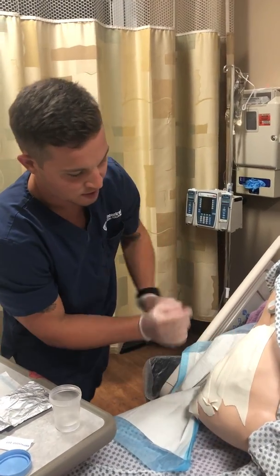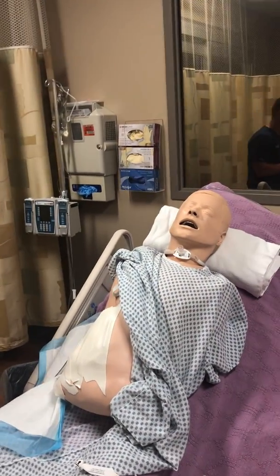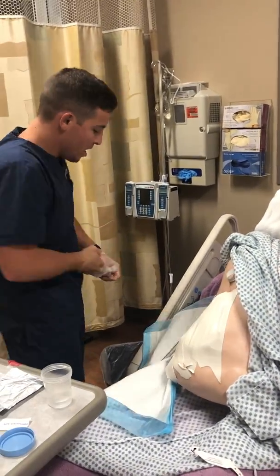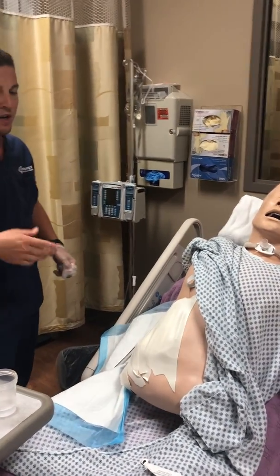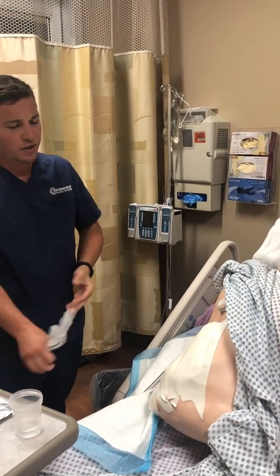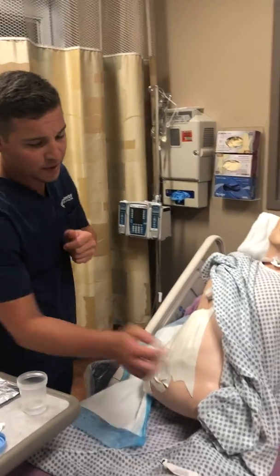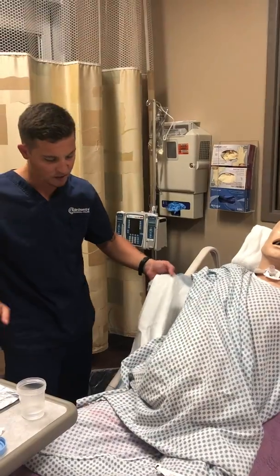Very good. So let's check in. How are you feeling here, Jennifer? We got everything changed here. I can get you covered back up. What I want to do is I'll want to initial the date, time, and my initials on here, just for our dressing change purposes. We're going to cover you up here, okay? Get rid of all this. I had tossed away all that.